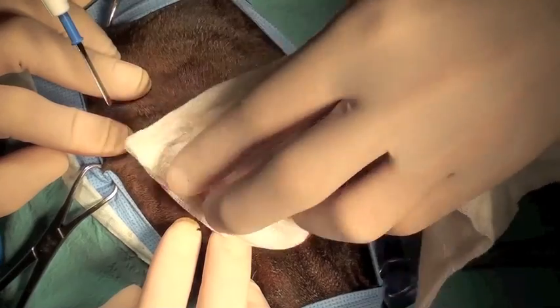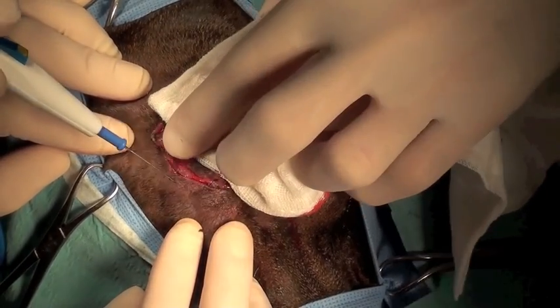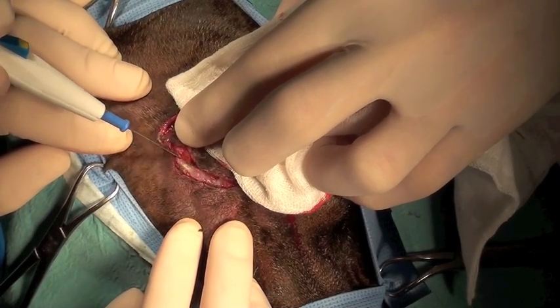At this point we're excising the previous biopsy tract in order to prevent tumour seeding from the previous biopsy.